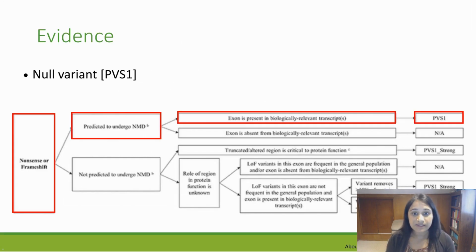So the first thing to assess when doing a variant curation is what type of variant is it. A duplication such as the one seen in this patient will shift the reading frame and result in a premature truncation codon. The patient's duplication creates a premature truncation codon in exon 5, which would cause the mRNA to be degraded via nonsense-mediated decay, as it is upstream of the last 50 to 55 nucleotides of the penultimate exon and the last exon itself.